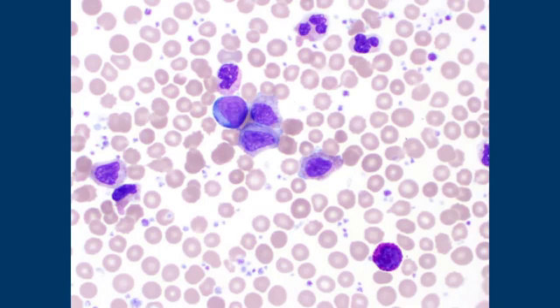Well, I feel like we've got a regular neutrophil there. I can't tell if that's regular and just folded funny or if it's a band maybe. That looks like something abnormal. I don't know what those are.